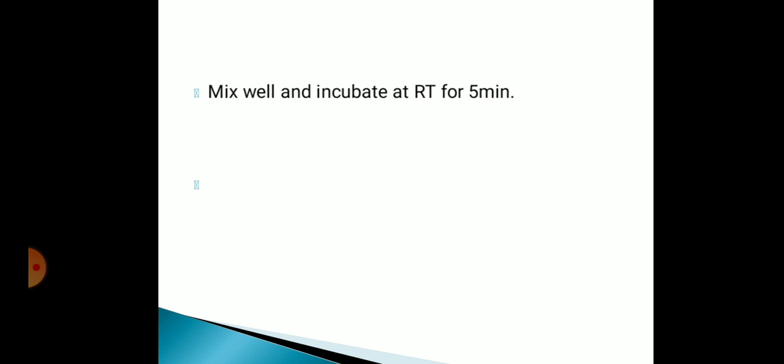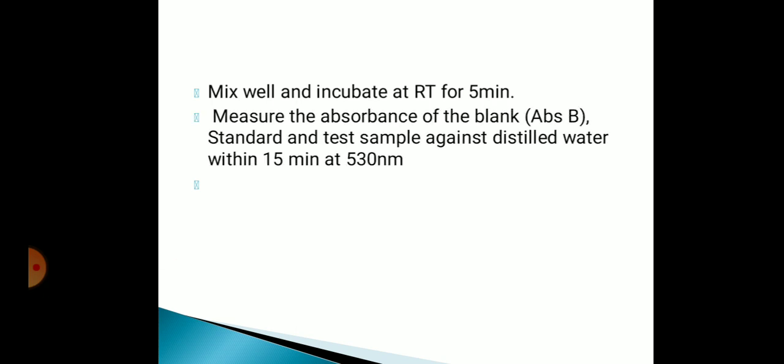Mix well and incubate for 5 minutes. Measure the absorbance of blank, standard and test against distilled water at 530 nanometer.